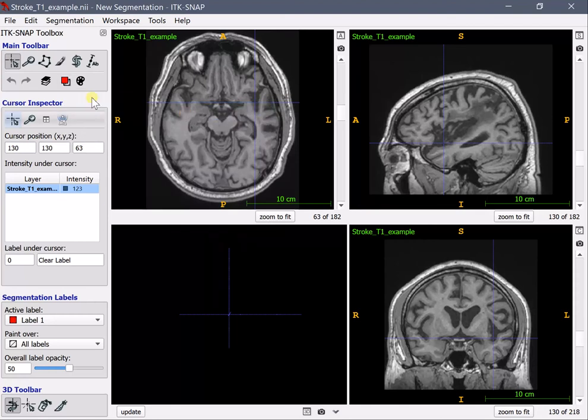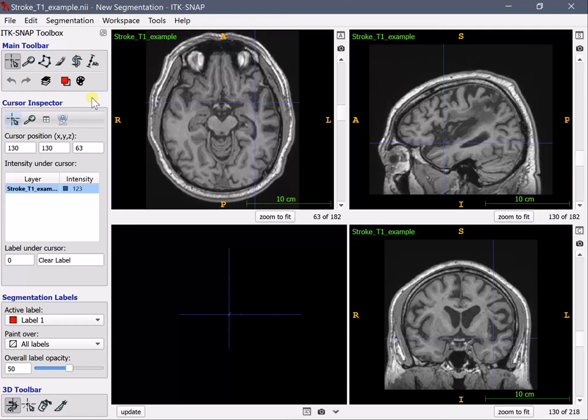Now for the lesion segmentation it's very important that you use a pen. In this moment I'm using Microsoft Surface which comes with a pen and this speeds up the drawing of the lesion by quite some bit.